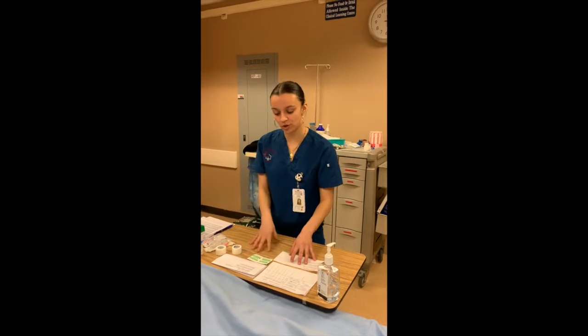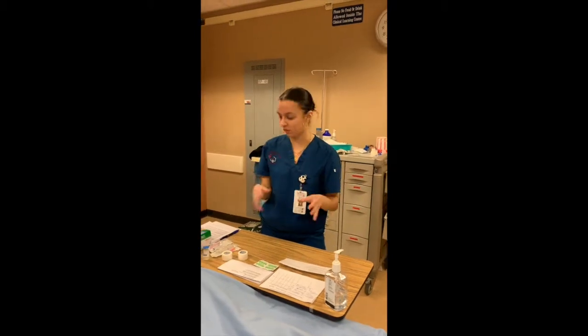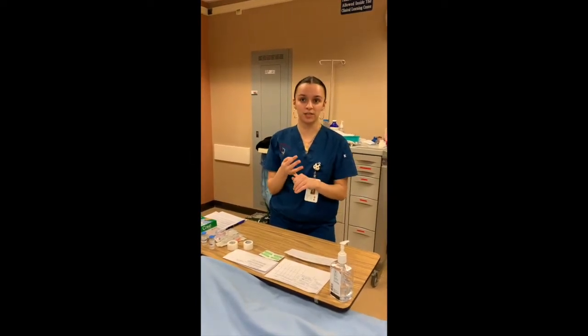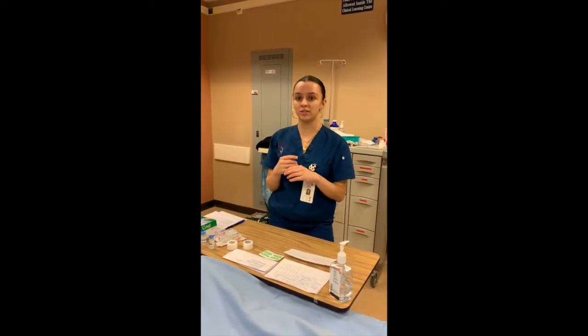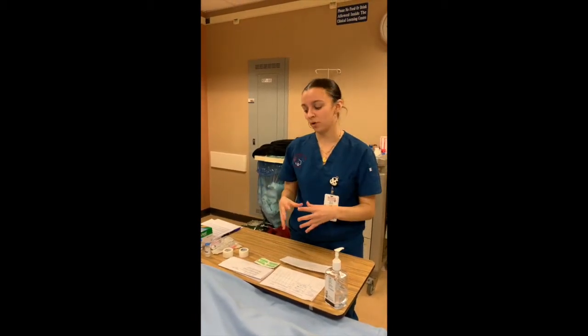And in order to ensure that the injection routine is going to be satisfactory and safe, we need to go over the 8 rights. So we do the right patient, right medication, right dose, right frequency and time, right reason, right documentation, right site, and right route. So now we can actually start with the whole procedure.